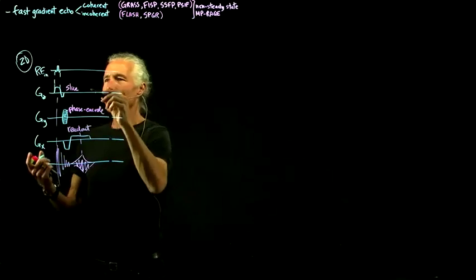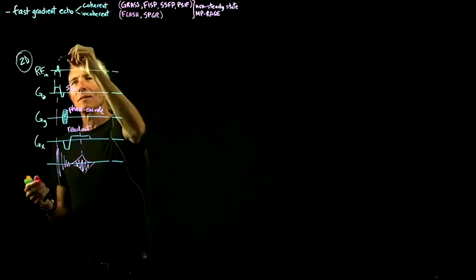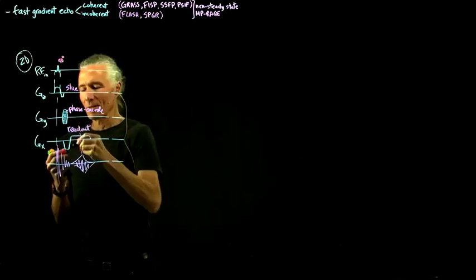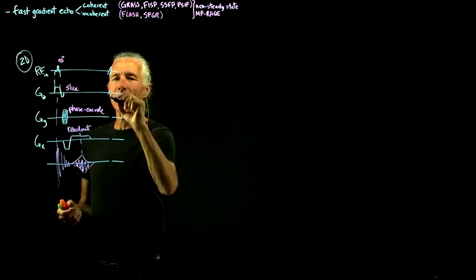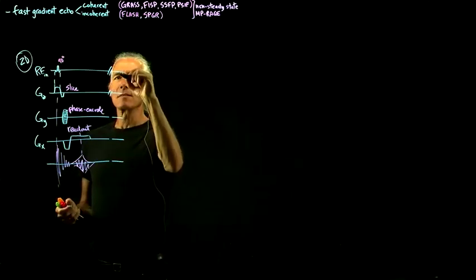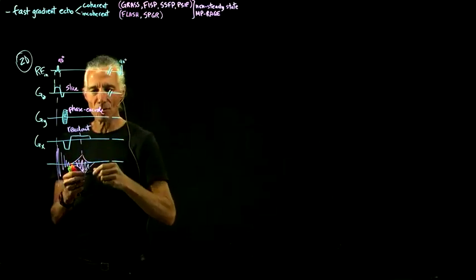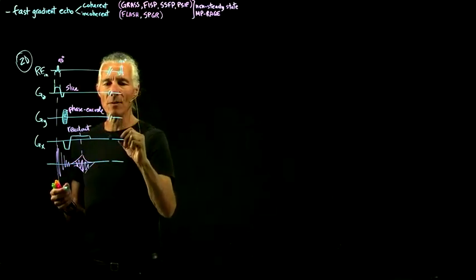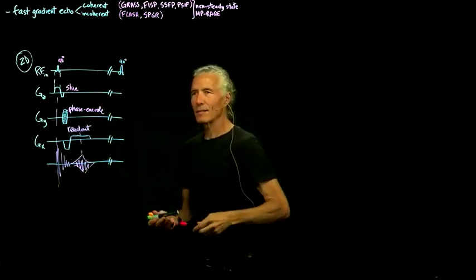So for instance, if we did a 90 over here, well, then it's going to take a couple seconds in order for that to recover. And so we wait a long time and then do another 90. So you can still do this. There's certain reasons you might want to do this, when you want to, this sequence is still on the scanner.